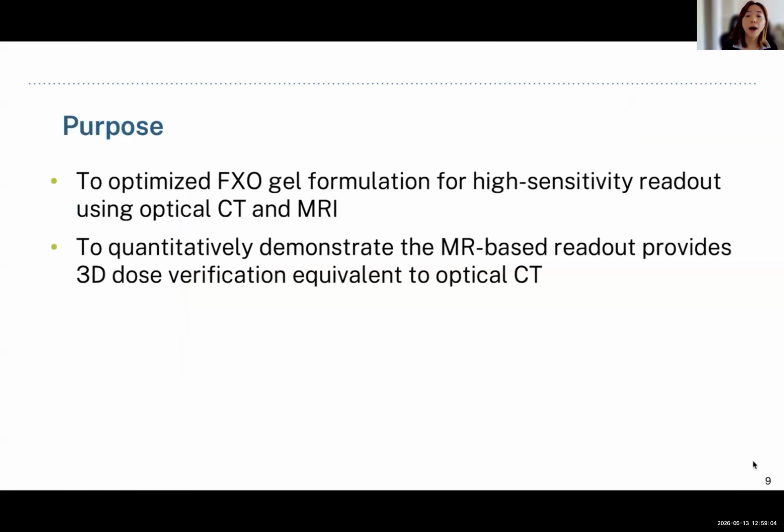Based on this, the goal of my project is to optimize FXO gel formulations that are suitable for both MRI and optical readout, allowing direct comparison between the two modalities. I will also be evaluating whether MR-based readout can achieve equivalent 3D dose verification performance.